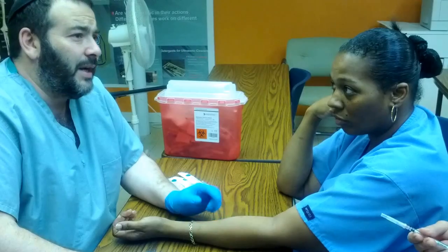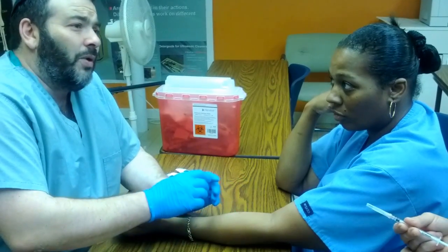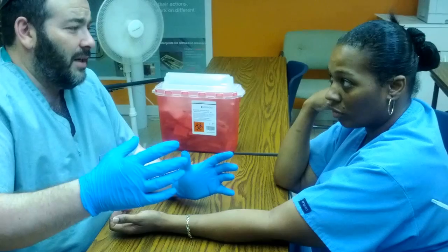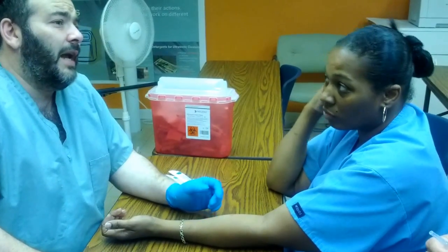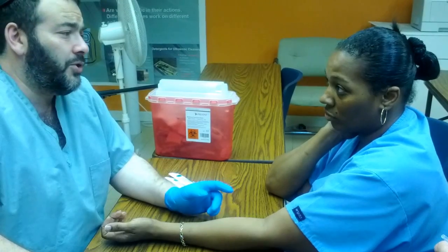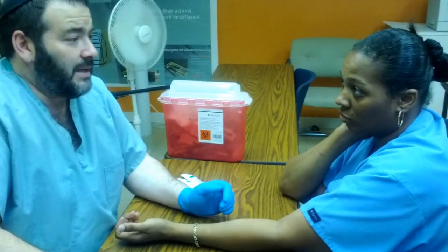Also, you will draw a circle around the base of your injection so you know where to find it later on, and ask the person not to wash it, smear it, or do anything else with the bubble. The bubble is going to be quite large, and you don't want it to extend past the circle that you drew. You're going to ask them to come back within 48 to 72 hours to determine whether they have a positive or a negative reaction.